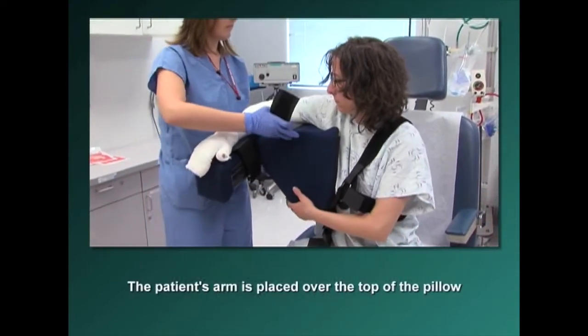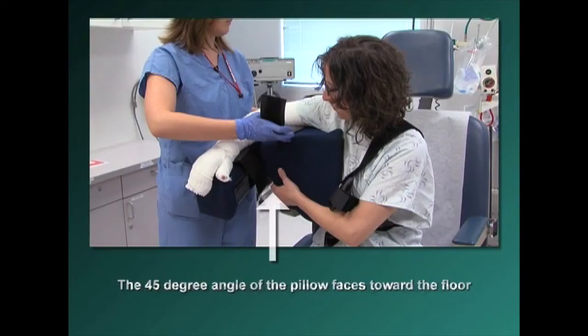The patient's arm is placed over the top of the pillow. The 45-degree angle of the pillow faces toward the floor.